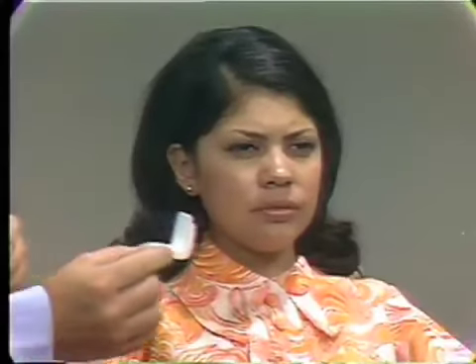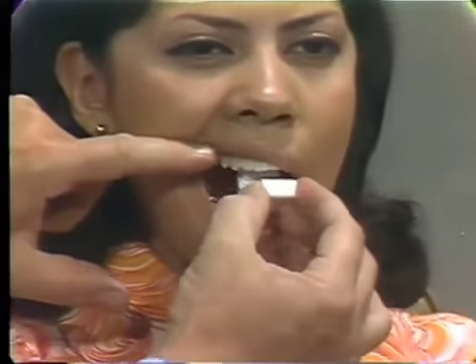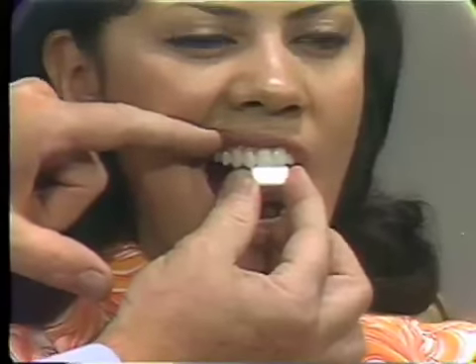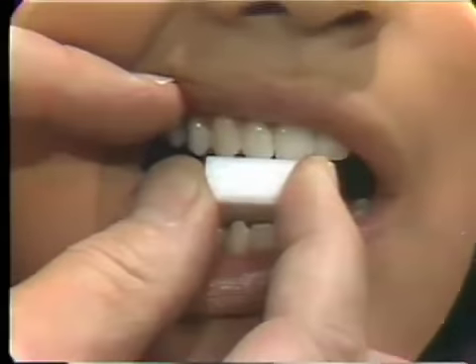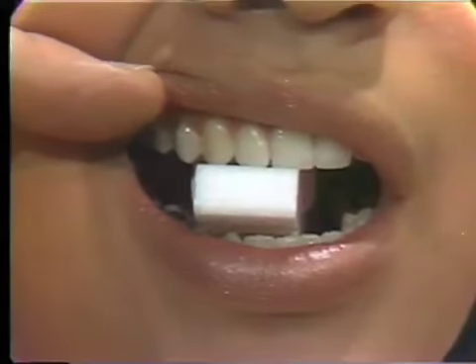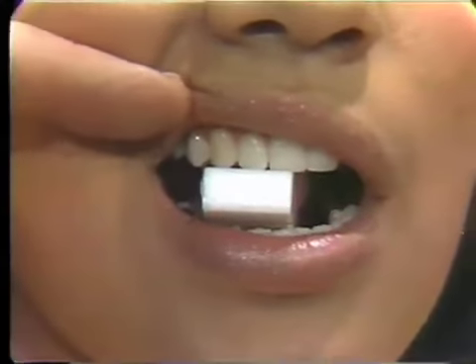So now we'll demonstrate how the film is placed in the patient's mouth for this region. So again, we use the number 0 size film in the bite block, grasping it between thumb and forefinger, placing it in the mouth with its upper edge against the roof of her mouth, and then I've positioned it just as though I was going to do centrals once again, but instead we'll move around the corner slightly until the lateral is in the center of the block, and then ask her to slowly close. That would be step number 1. Steps 2, 3, 4, and 5 would be followed in the same manner as I described with the centrals.